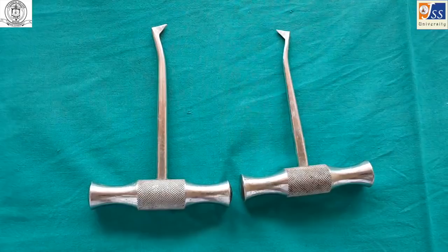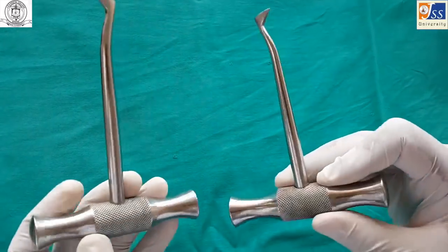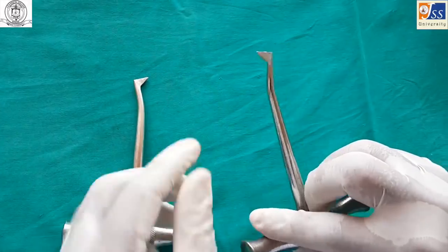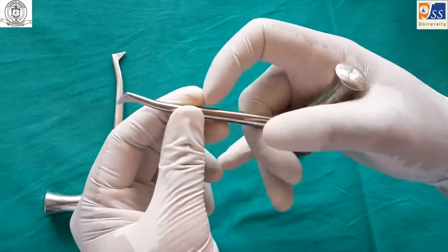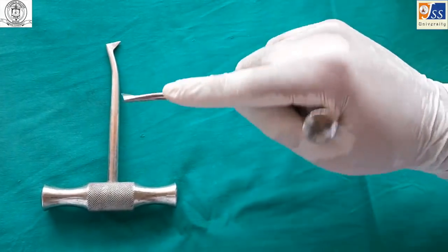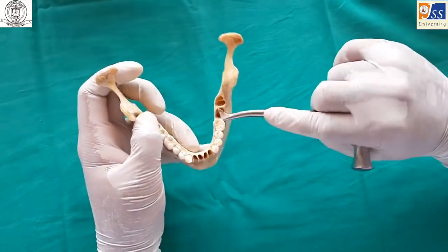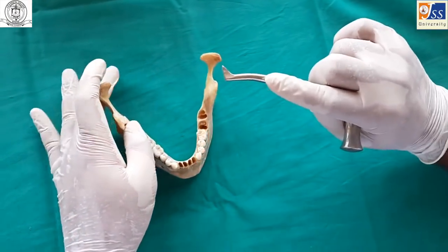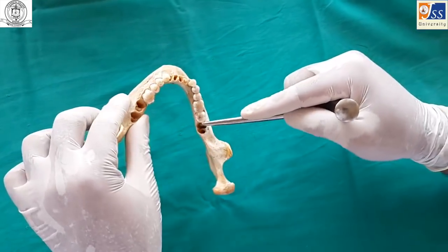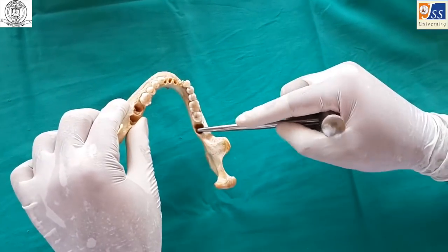The crossbar elevator, also known as Winter's crossbar, is a paired instrument. If one is used as distal on the right side, it can be used as mesial on the left side and vice versa. It is held in a palm and thumb grasp and primarily used on the wheel and axle principle. It is used for extraction of mandibular teeth, and is useful when one of the roots has been removed, allowing the elevator to be used through that socket to remove the other roots.